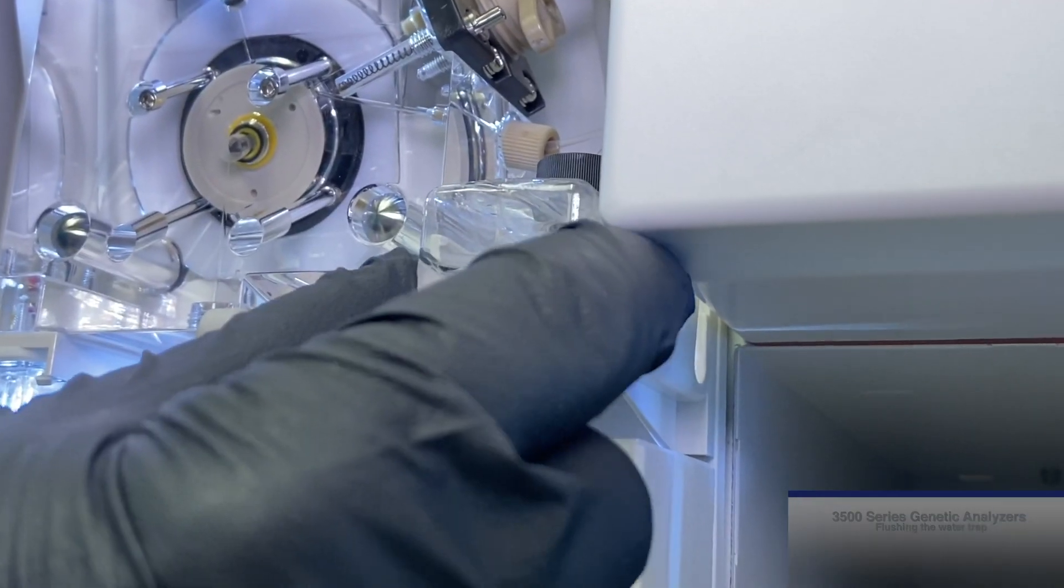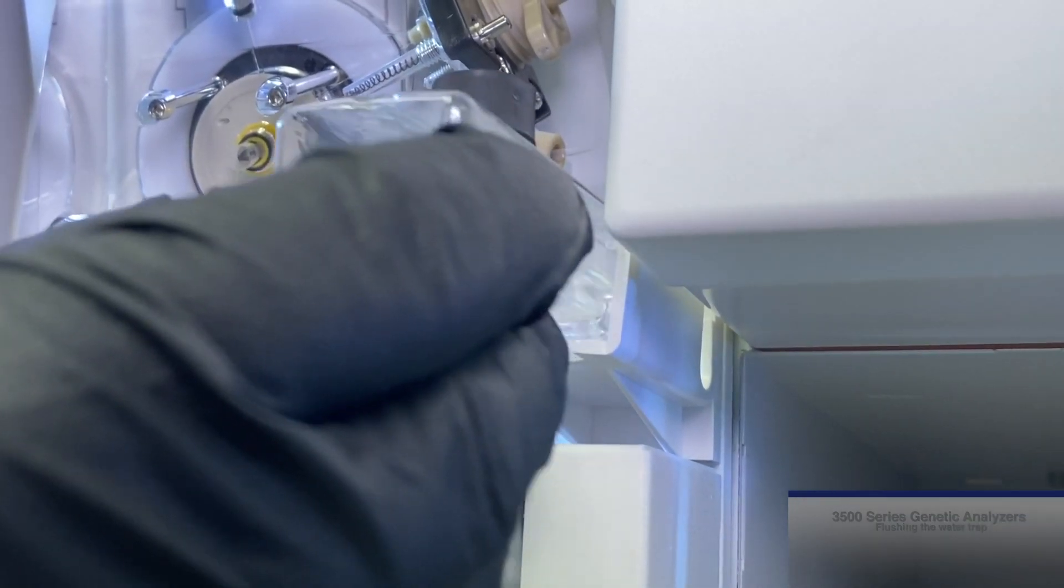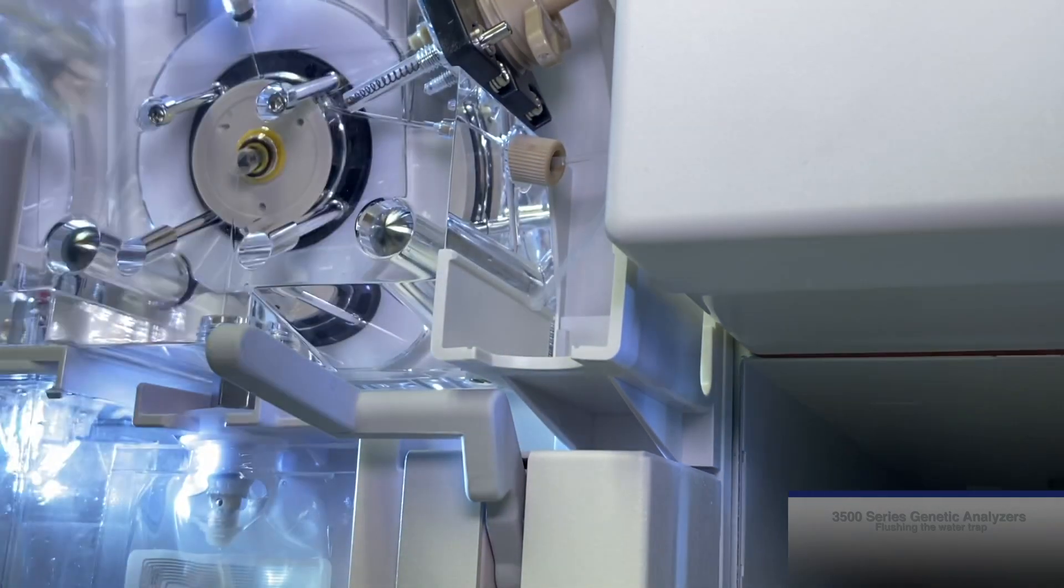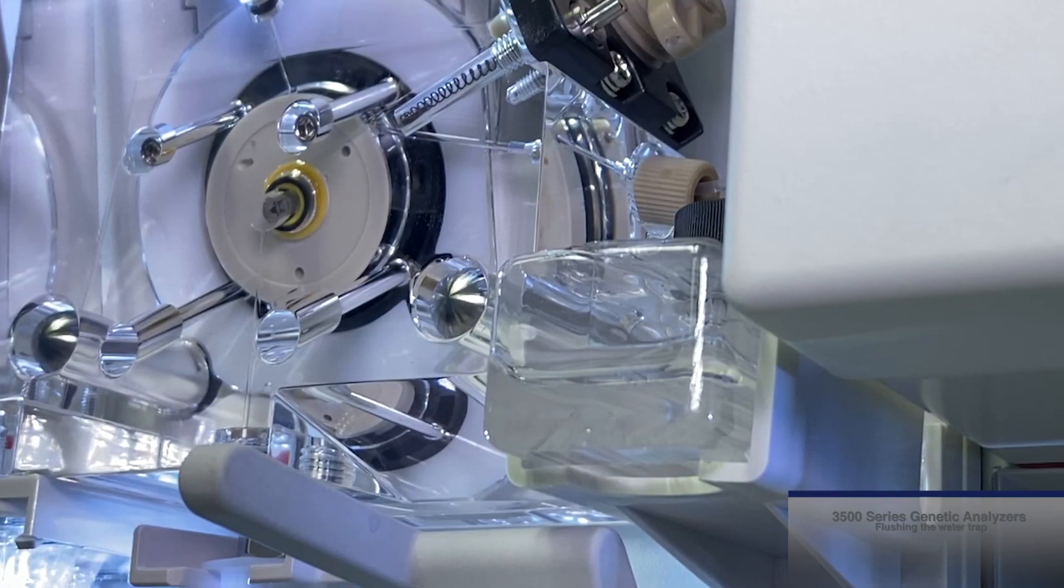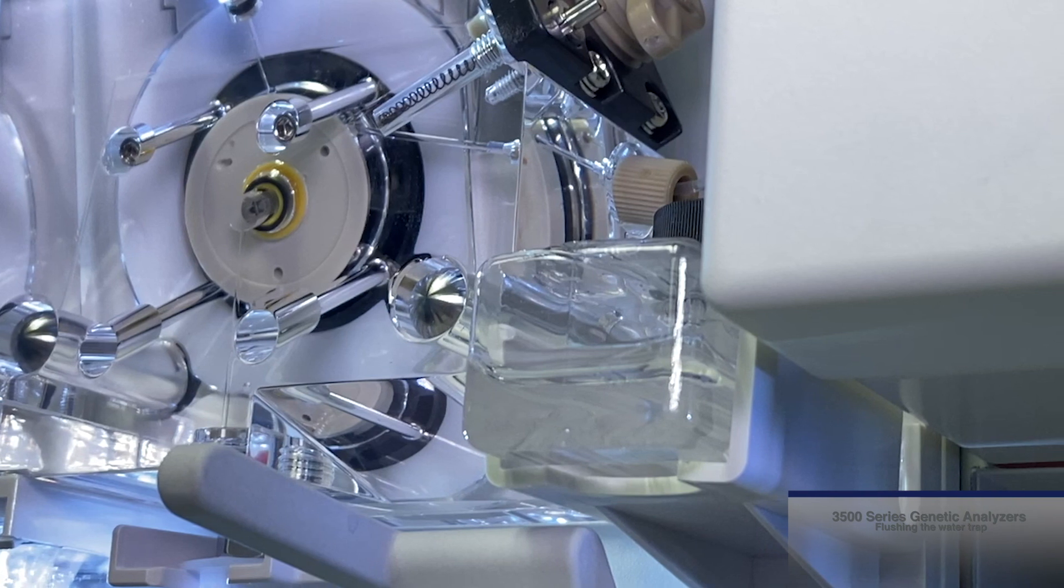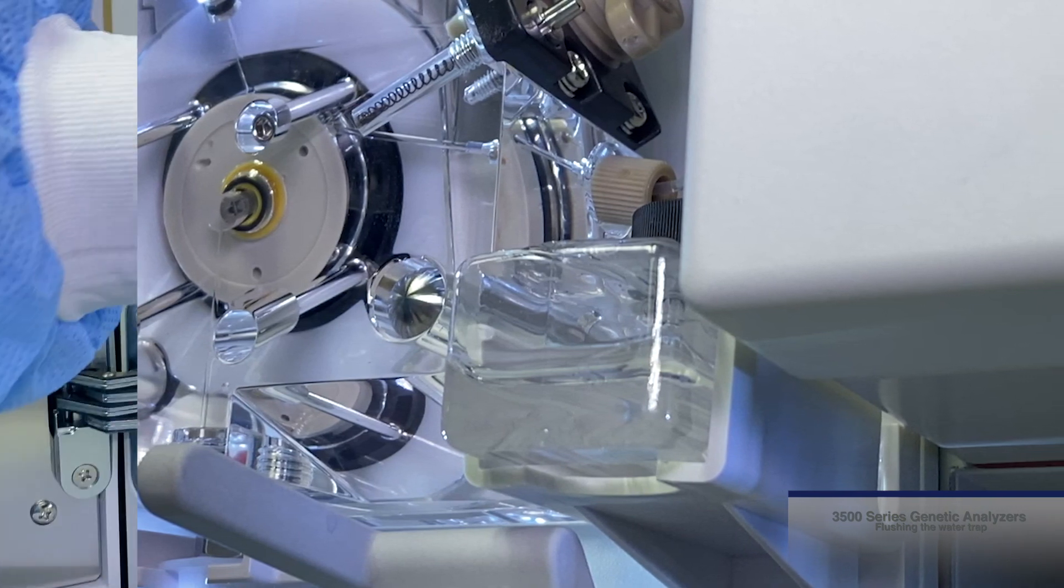Once complete, empty the water trap waste container which collects the water that was flushed through the water trap. This water trap waste container can be removed prior to flushing the water trap and replaced with an empty beaker to catch the water.